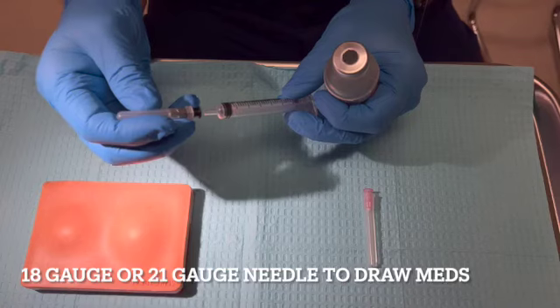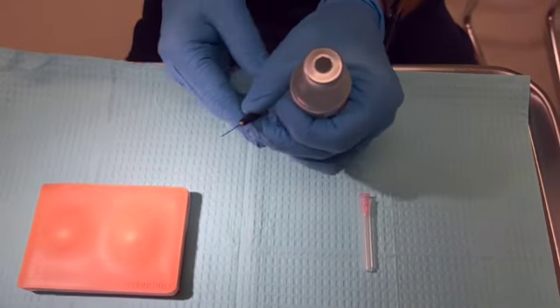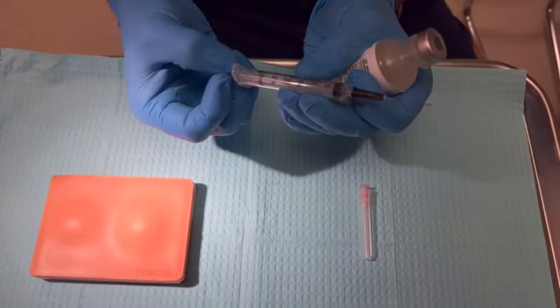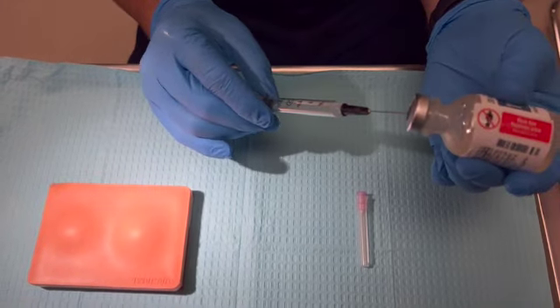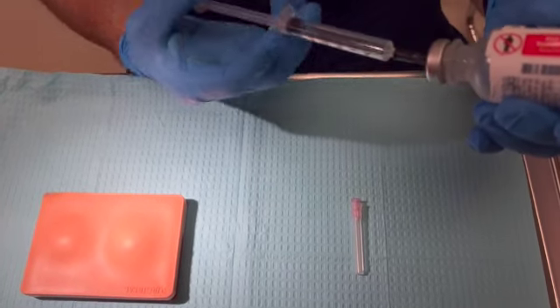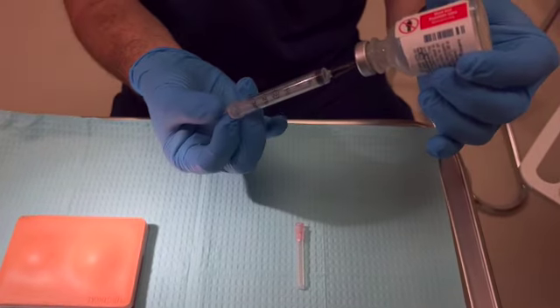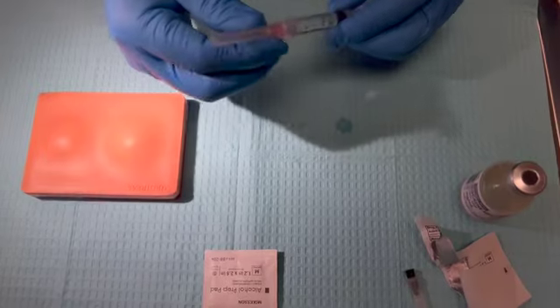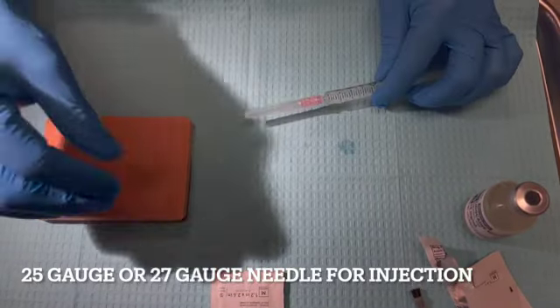We're going to use a larger bore needle in order to draw that medication up. Frequently, I will pull back on the syringe, invert the vial, and insert air into it, and that allows for an easier drawback of the medication. I'll now put on the smaller needle, usually a 25 gauge, or a 27 gauge can be used.